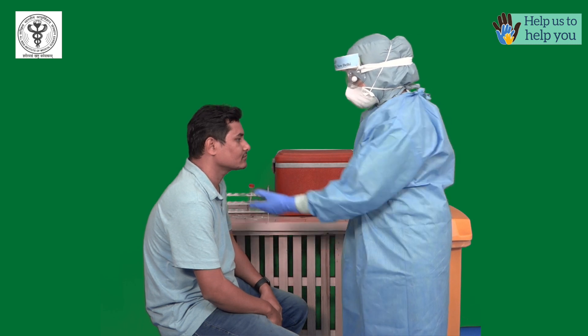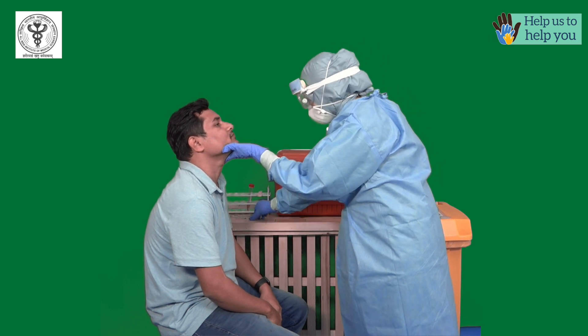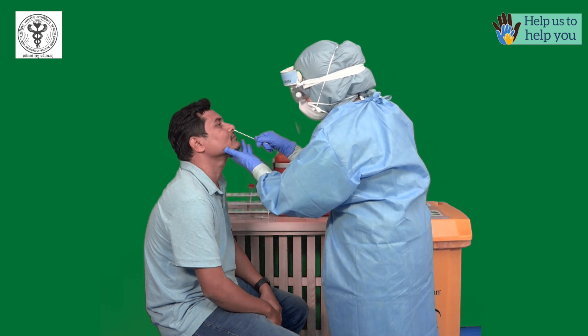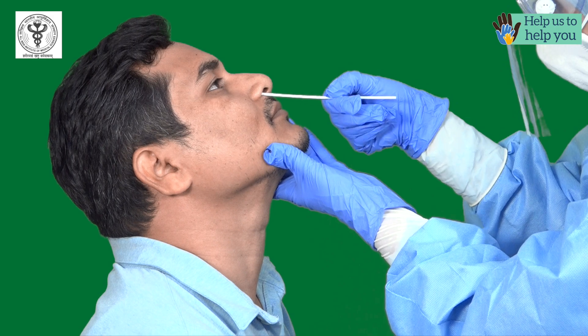For nasal swab, don on the complete PPE. Tilt the head of the patient to 70 degrees. Insert one swab into the depth of nostril, twirl the swab for 5 to 6 seconds and slowly remove it.